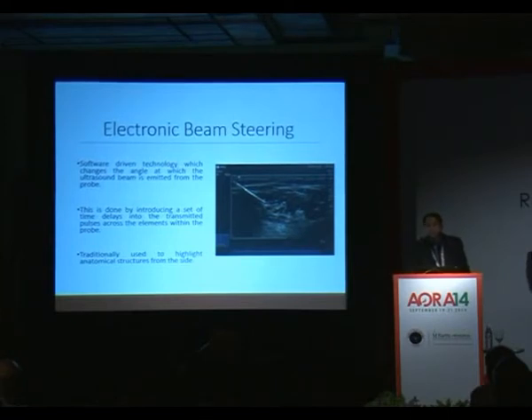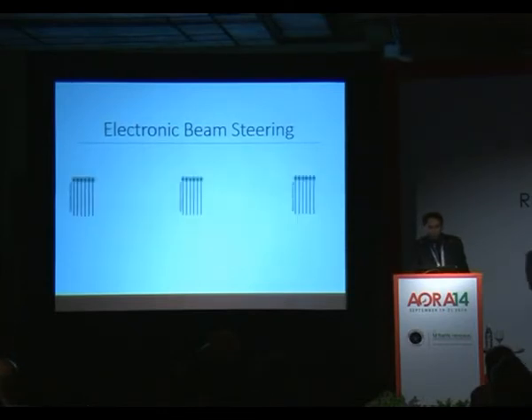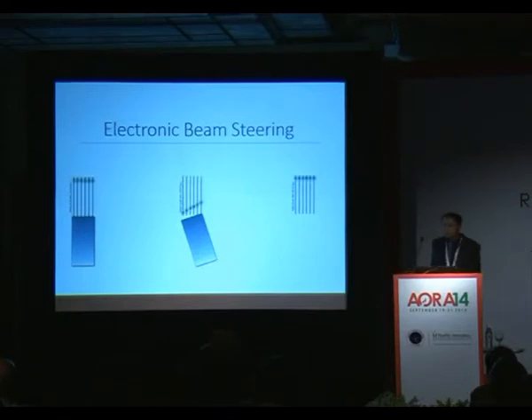It's traditionally been used to highlight structures on the side by the radiologists. So schematically looking at it, the ultrasound signals would usually travel vertically with a fixed set of time delays, and this would give a straight beam. But if we were to introduce a little bit of time delay among the signals, the beam would slightly slant to the side. Okay? This works the other way around too.